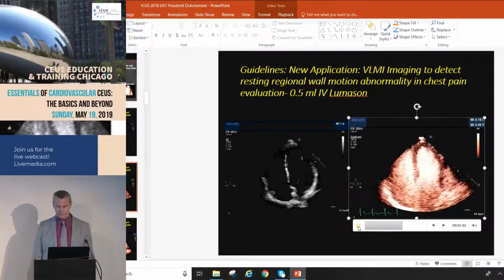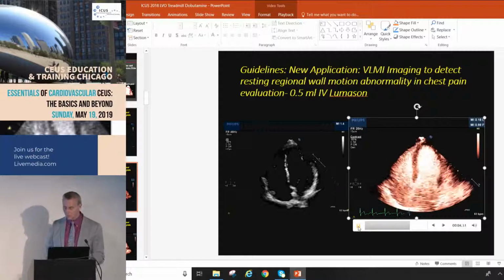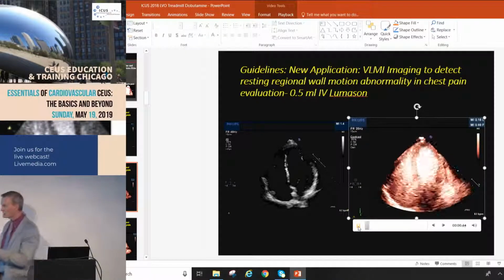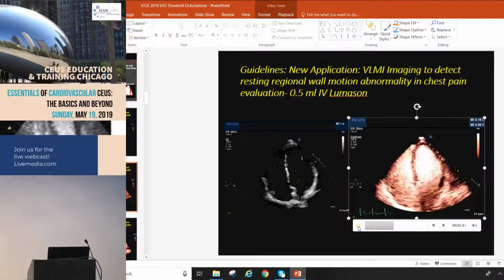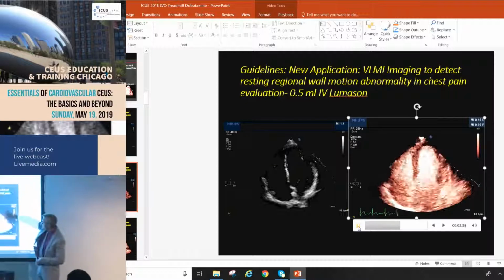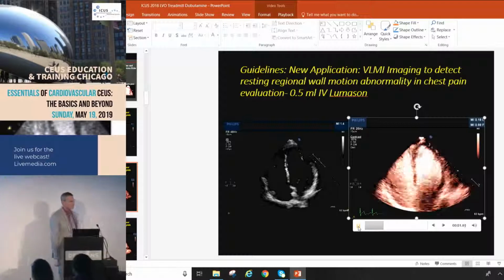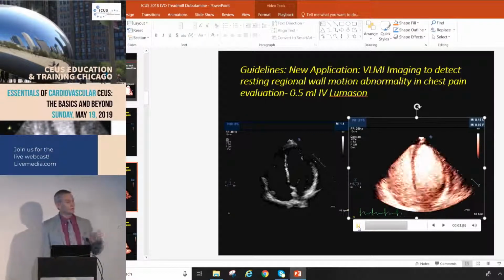Now what would you say? Look at it a little bit. Just wall motion. We're not talking about perfusion. You can see everything better now, that's all. What about here? If we don't see more than 2 segments, we are automatically using the contrast. Good. Then how do you use it?